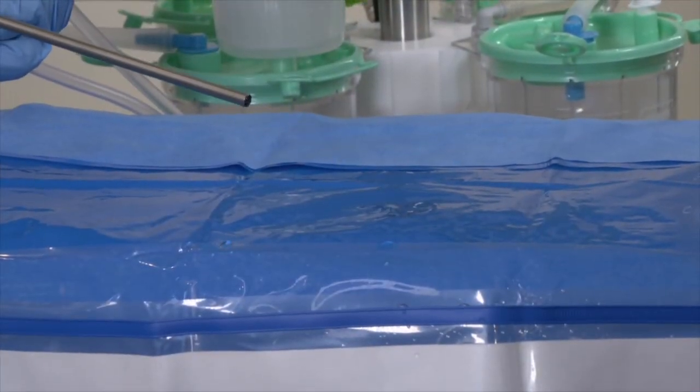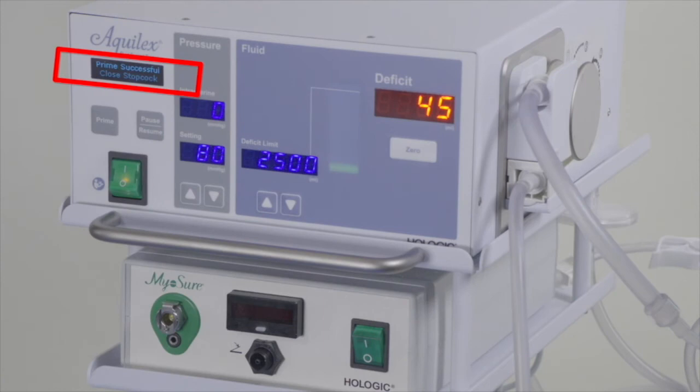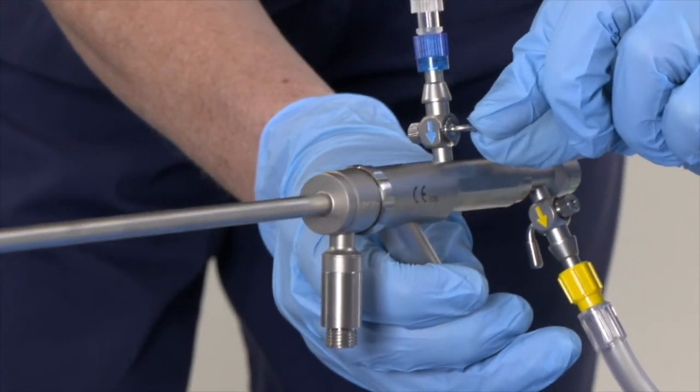The pump will make an audible sound when the calibration is completed, and the screen on the Aquilex will display "Prime successful, close stopcock." Press the pause resume button to stop the fluid flow, or the clinician can close the inflow stopcock on the hysteroscope.